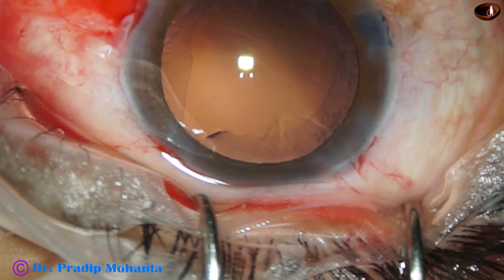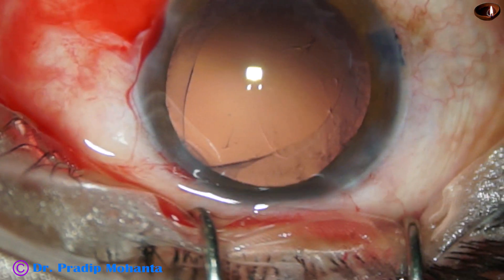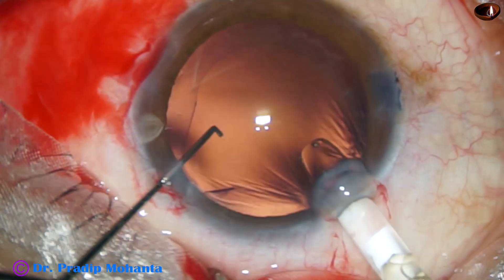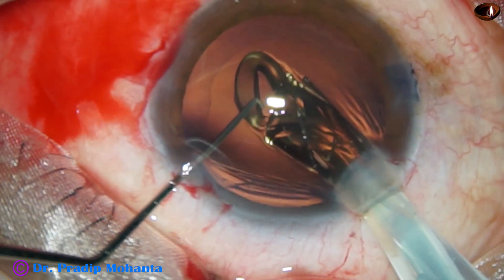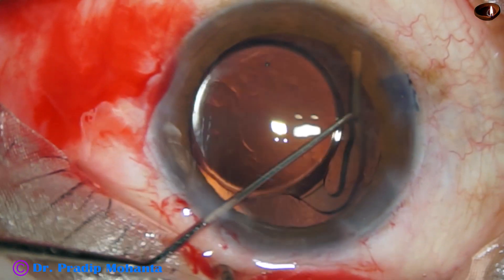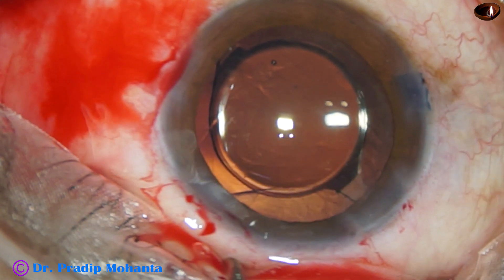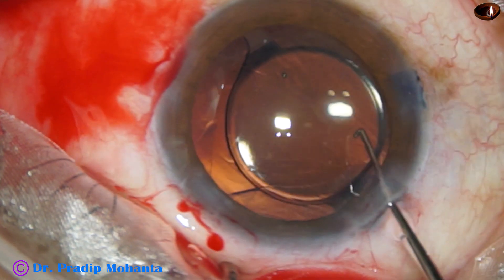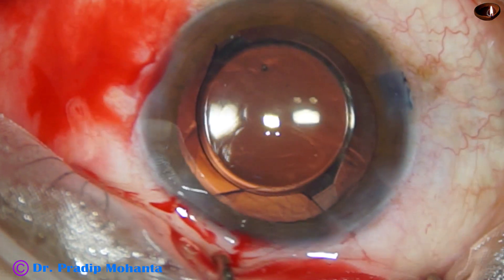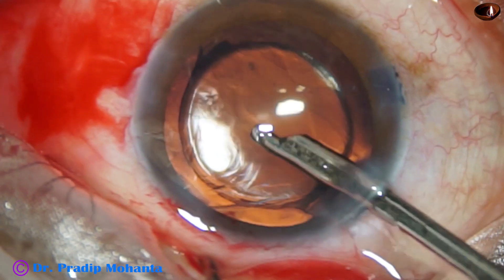I inject viscoelastic and fill up the anterior chamber and capsular bag. I was fortunate that the rhexis did not extend posteriorly. This is an intraocular lens from NIDEK — the haptic appears to be really long. The extension is at 2 o'clock, so the haptics should be placed 90 degrees away from that point.